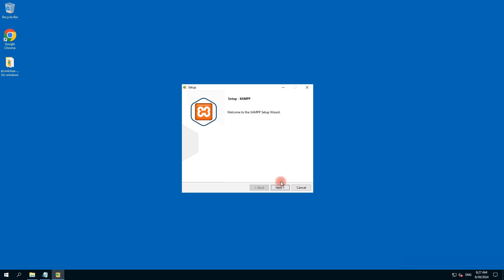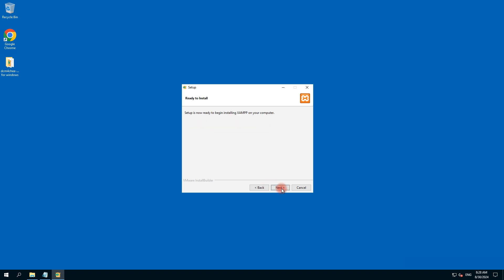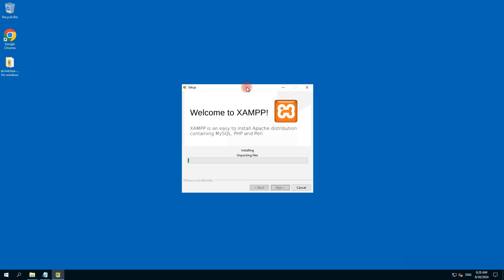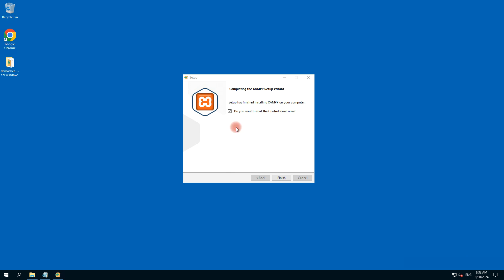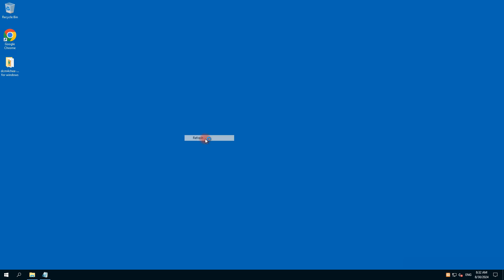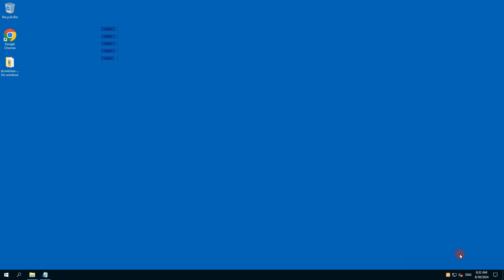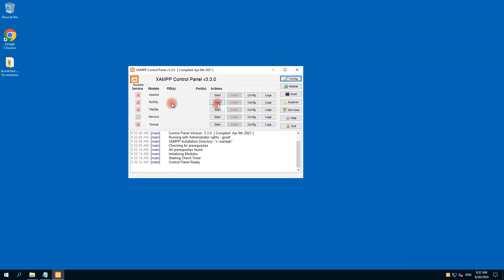Click next — it should have all these things checked — next, next, next. That's installing. XAMPP is installed. Do you want to start the control panel? Yes, it's finished. Now let's start MySQL only — we don't need all these things, so we just start MySQL.